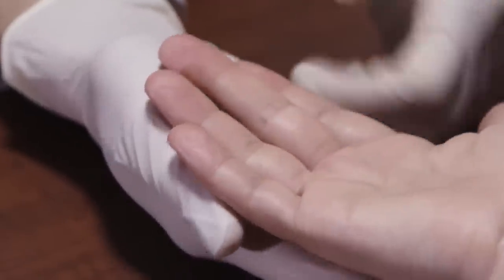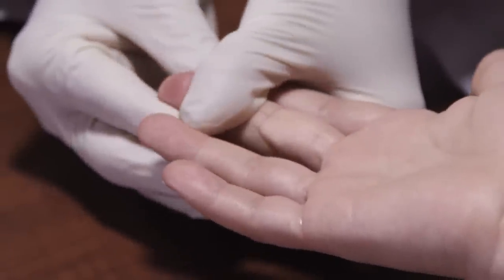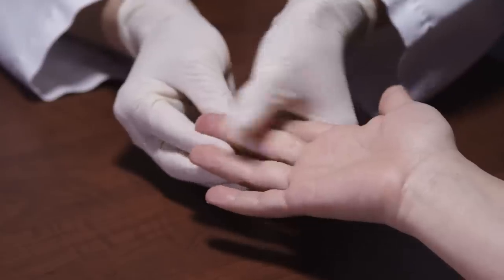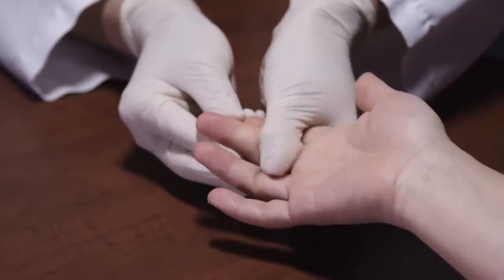Massage the finger with a downward motion several times before performing the finger stick. Lower the hand to below the heart level when collecting blood.